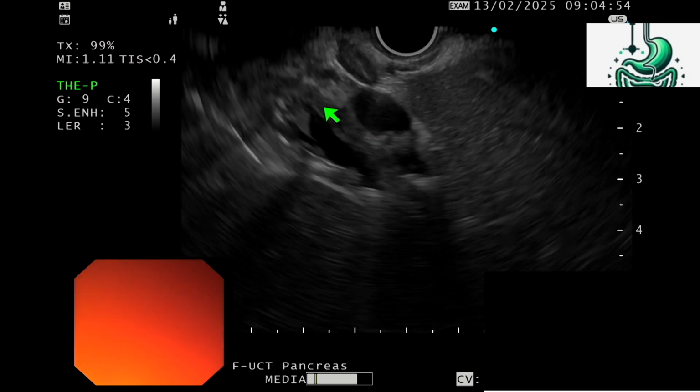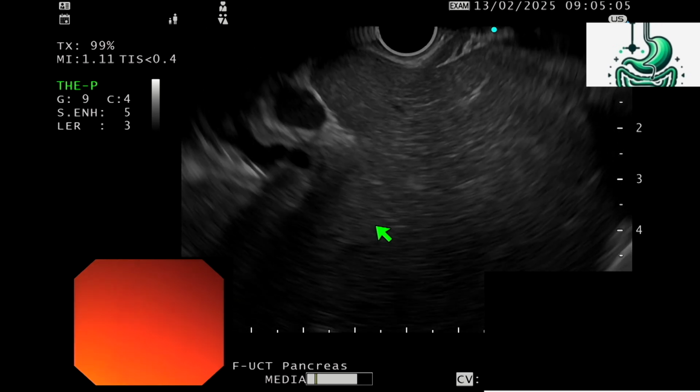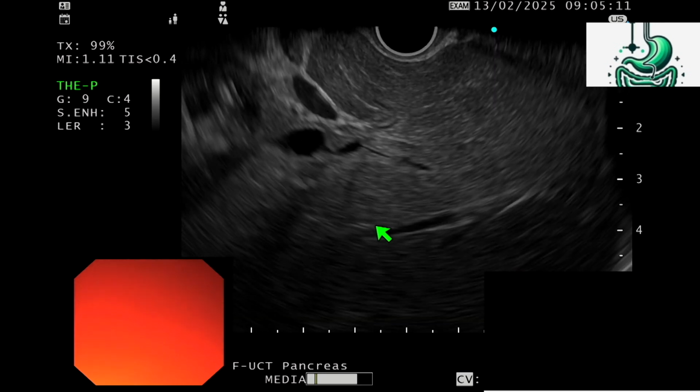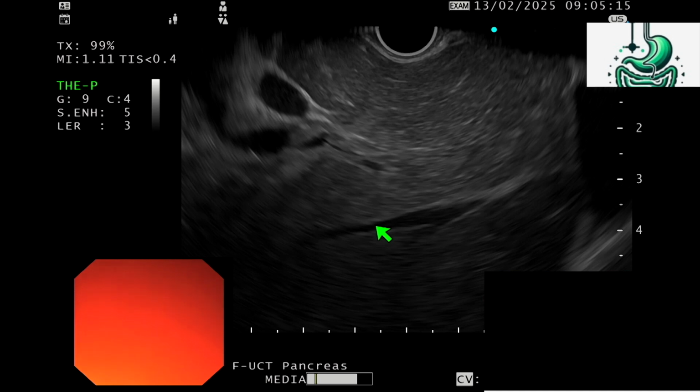Yeah, one minute. I'll just show the thickened bile duct. You can see the bile duct is very thickened. And then there is no ductal dilatation intrahepatically. See that? That's the sclerosing variety of changes there. You can see now, the bile duct is thickened, and then there is a very thin intrahepatic duct. There is no intrahepatic biliary ductal dilatation.